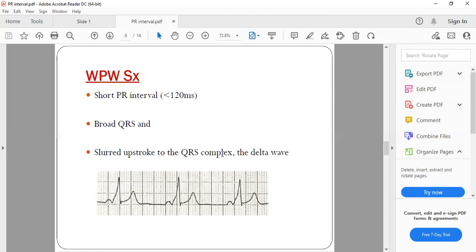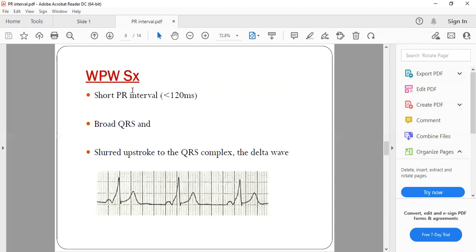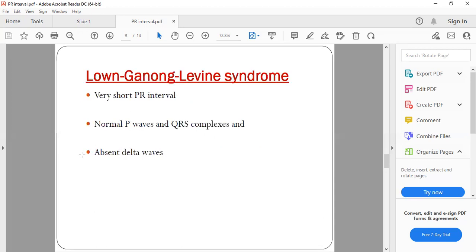We will be talking about WPW syndrome in the next session in more detail. This slurred upstroke is the delta wave, characteristic of WPW syndrome. Now, Lown-Ganong-Levine syndrome also has a very short PR interval, but it has normal P waves and a normal QRS complex, compared to WPW where there is a broad QRS.